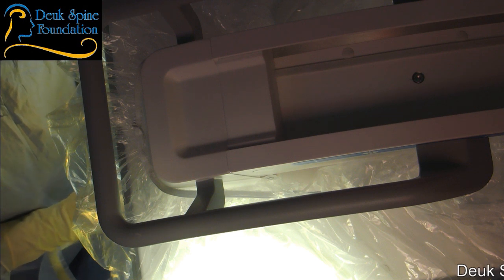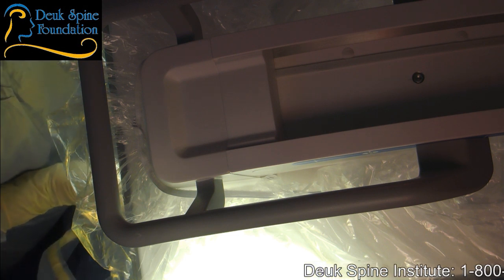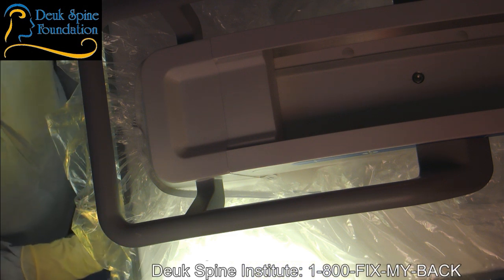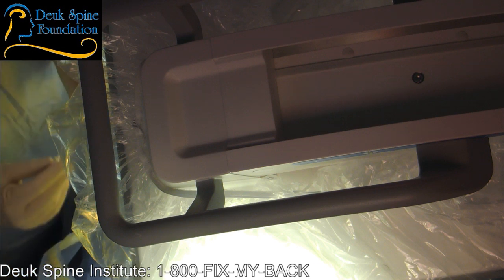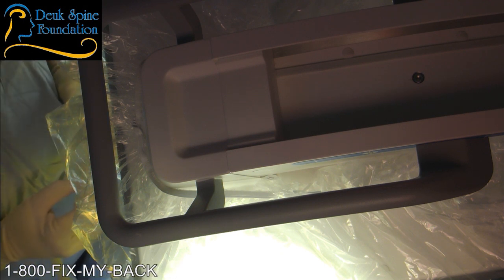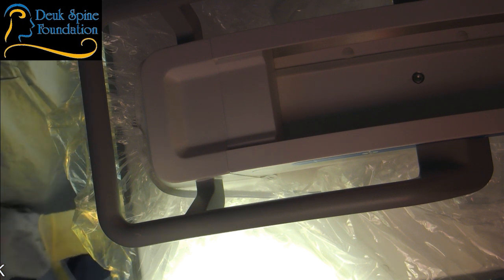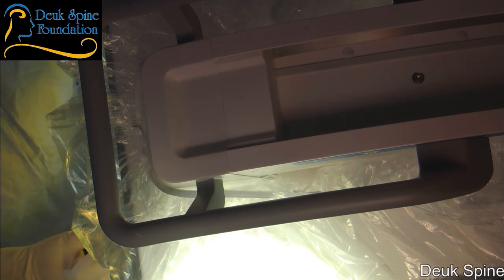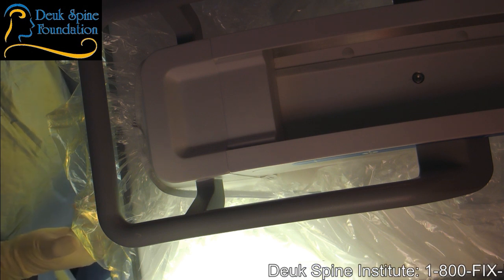Now, typically with these types of surgeries, I can usually get all three levels with one incision. However, sometimes I cannot, and it just depends on the spinal alignment, the plane of the discs. Everybody's a little bit different, but we're certainly going to try. Okay, very good. Now, do you want to make any more positional changes before I get started, or are you comfortable? Perfect. All right, we're going to go ahead and get started. So the most difficult disc to access transforaminally is L5-S1, and I always start with L5-S1 if that's needed for that particular patient, as it is with this patient.